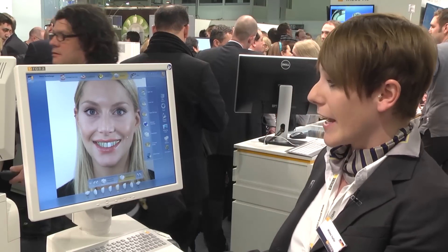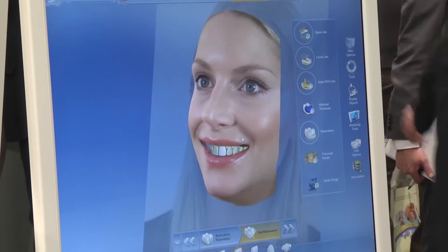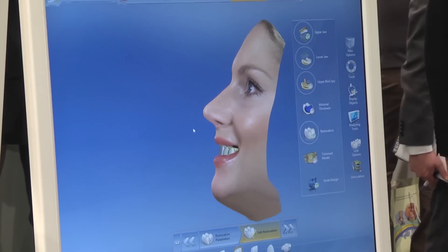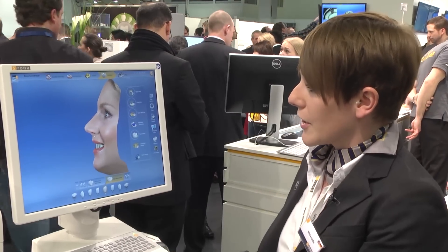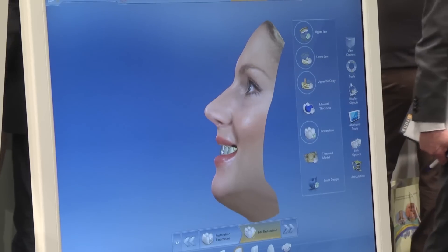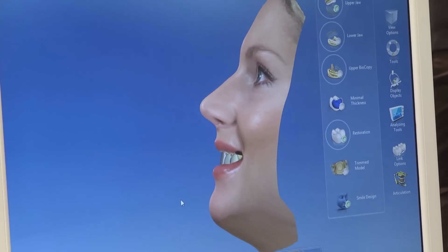Another very interesting aspect is that you see a 2D picture here, and we make a 3D model out of it. If I move the face, you can see it becomes really lifelike, and therefore you can also position the crowns in regard to the labial area and whatever you'd like to adjust.